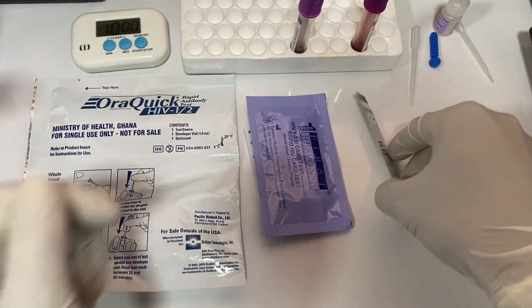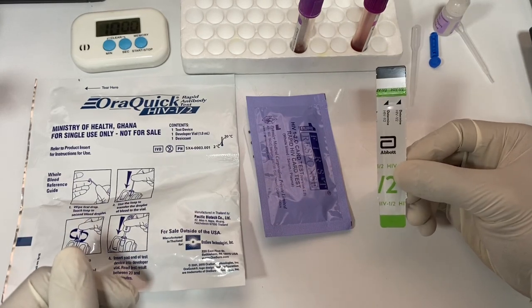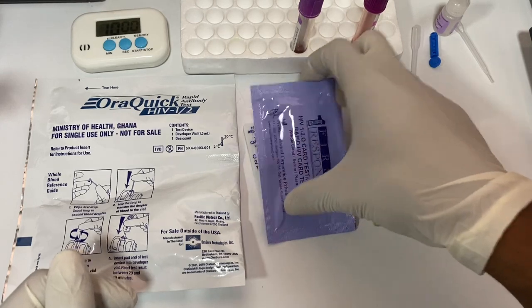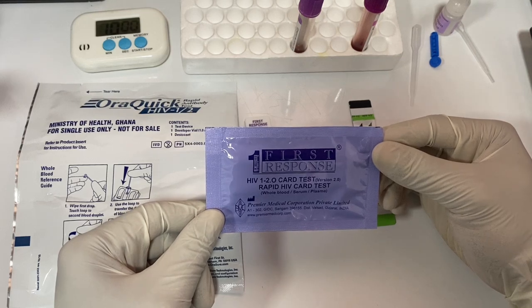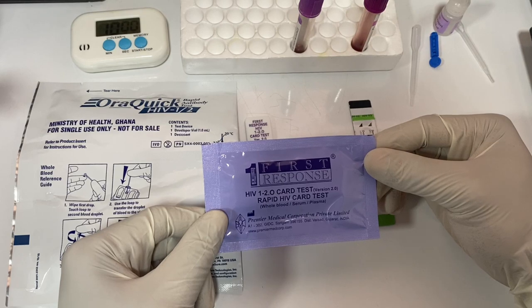To test for HIV 1 and 2 in the lab, we have this test strip. This one was developed by Abbott — we are going to use it and learn how it's used. Then we have this one also, and what's special about it is that it is able to differentiate between HIV 1 and HIV 2.